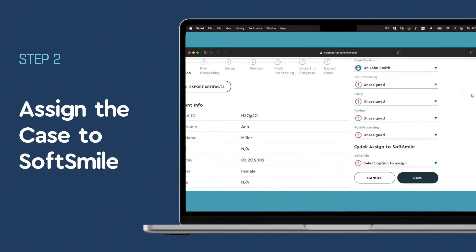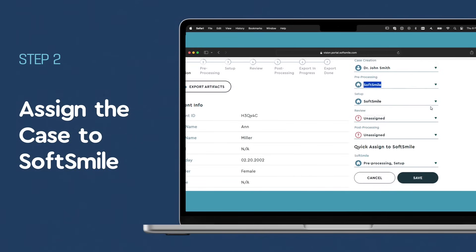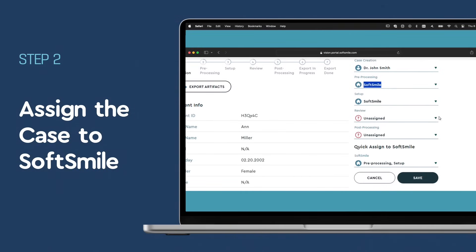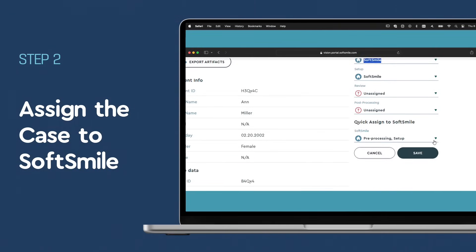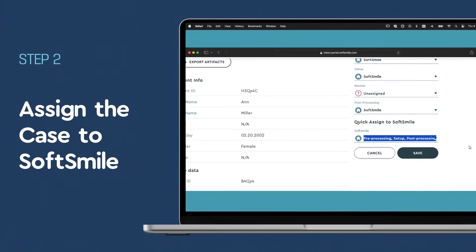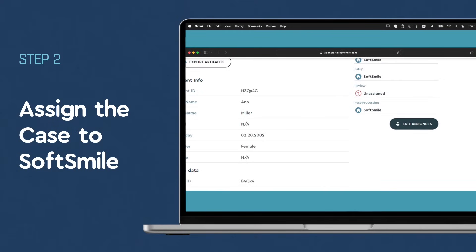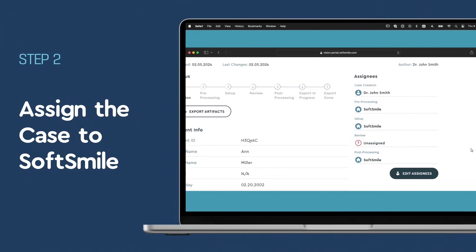Assign the case to SoftSmile. With scans uploaded, select Assign Case, choose SoftSmile, and Save. You have the flexibility to update case details any time before the setup begins.